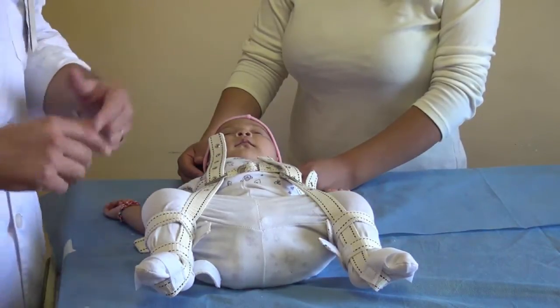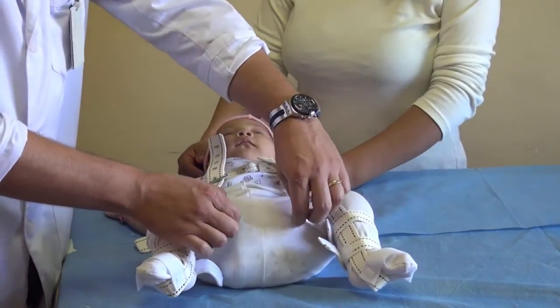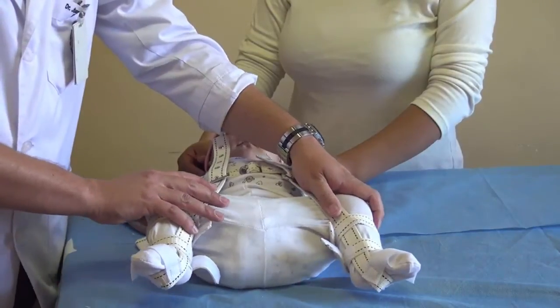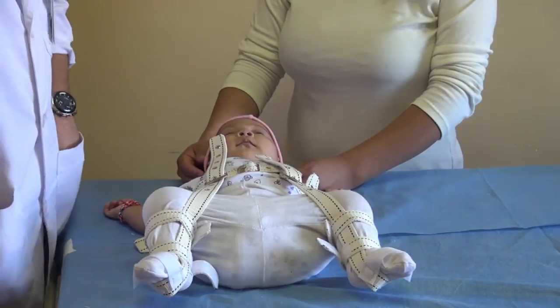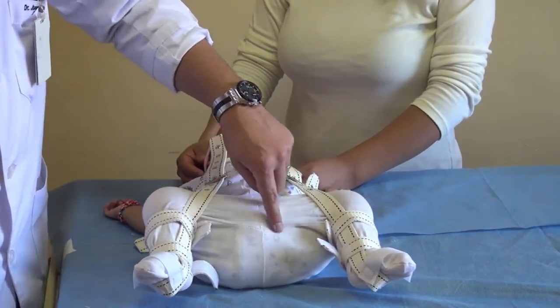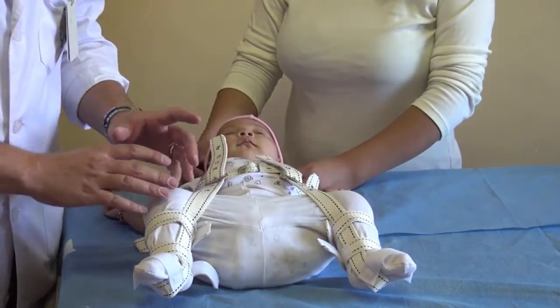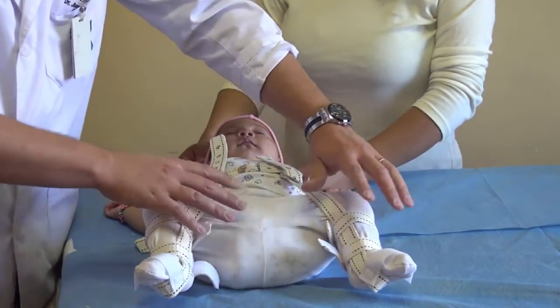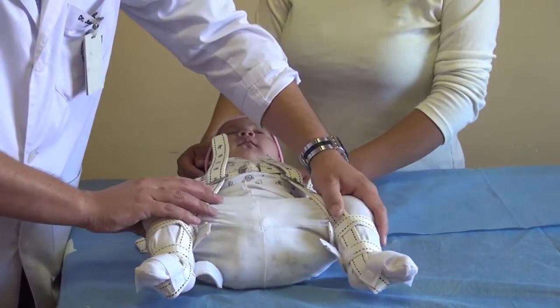When you use clothes like these pants, some of them are really tight and they do not let the harness do all the abduction that the baby needs. So we tell the parents to use a pair of scissors to open the seam this way and that way, so the baby can use the clothes to protect their lower legs, but there won't be tension and the harness will be able to open and abduct both hips.